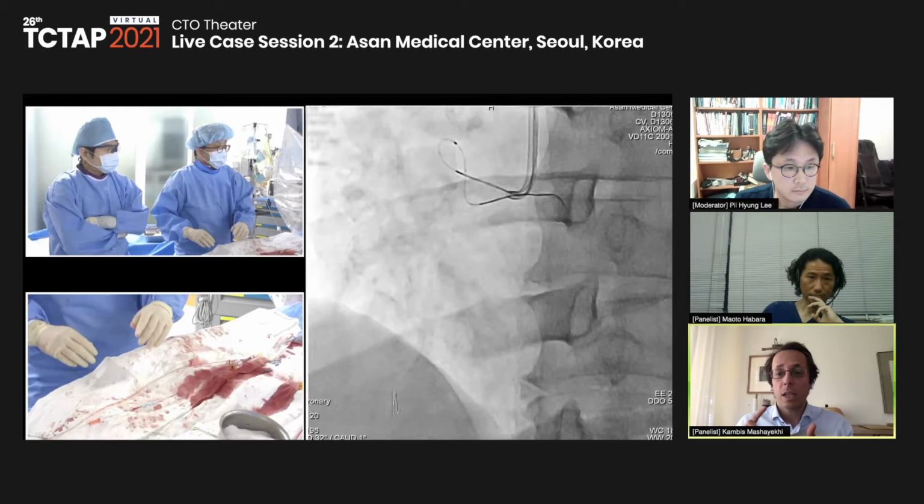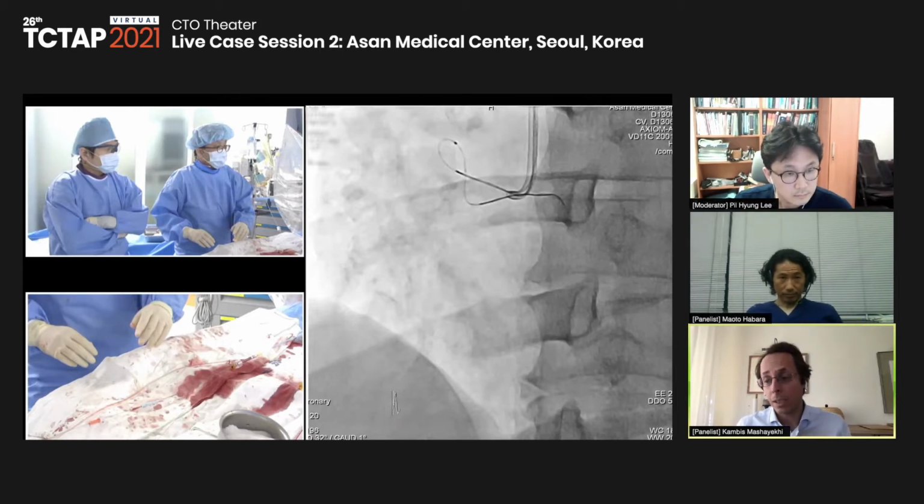It's also a very good case, once the case turns into retrograde, to evaluate retrograde options, which are probably septal, but also epicardial ones. We may go later on to the epicardial analysis and also to understand the different scores we have nowadays for analyzing epicardial passage. So I think it's a very interesting case.